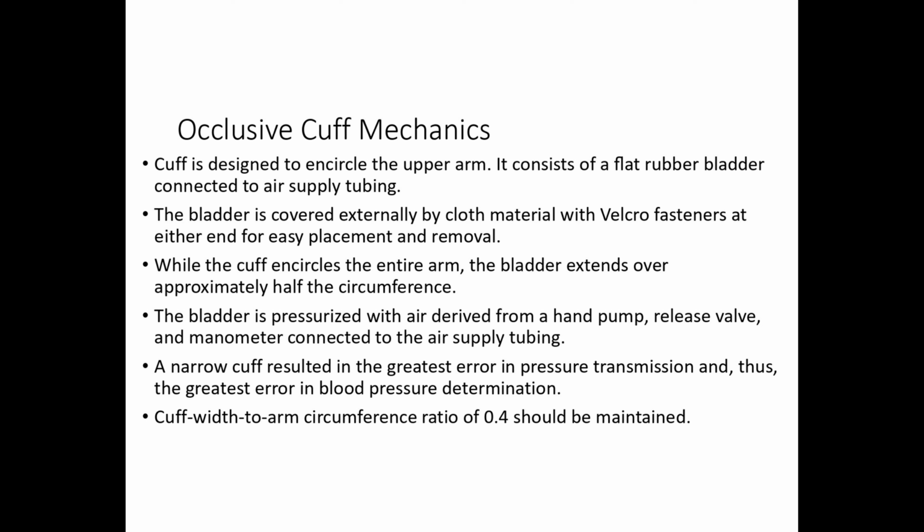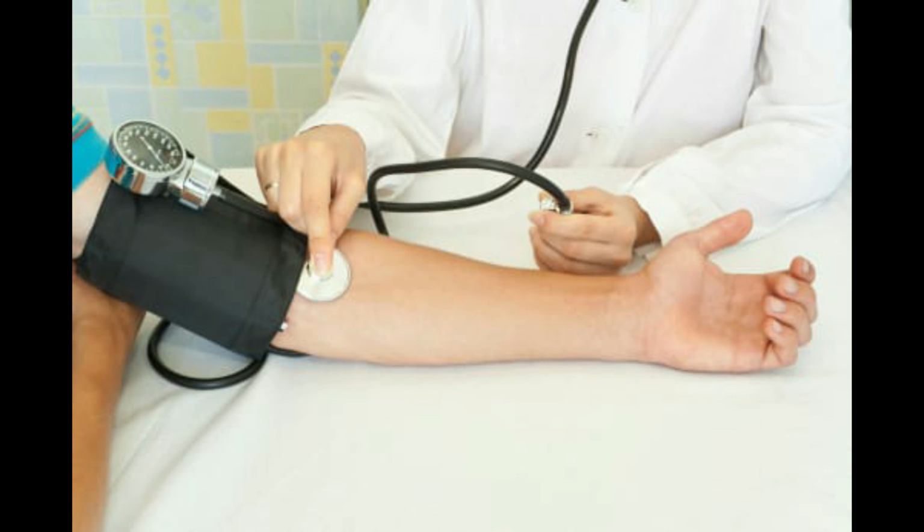Now let's look into the methods, the Korotkoff and the oscillometry methods, the two major methods we need to know about in NIBP or blood pressure measurement. When you do a manual blood pressure measurement, we tie the cuff on the upper arm, and nurses keep a stethoscope and observe a sound, a heart sound. That method is basically the Korotkoff method.